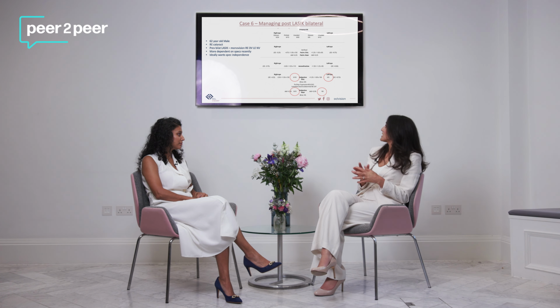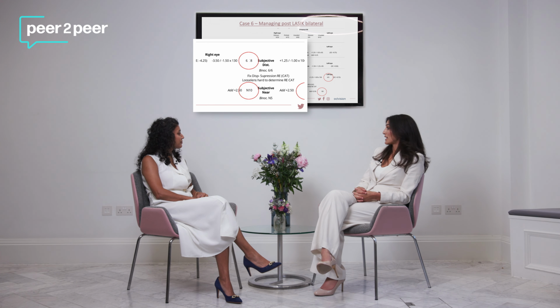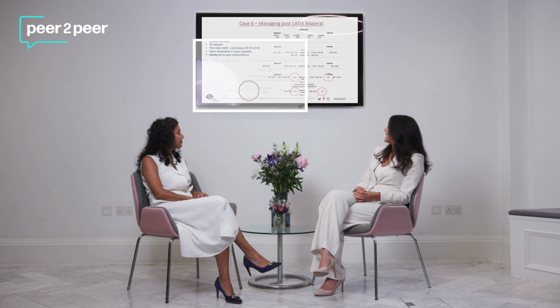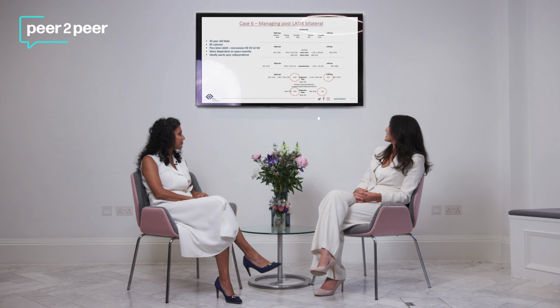So when we're looking at his vision, you can see that it is reduced. He's myopic in that eye, so he's had some degree of regression over the years, or he's developed myopia due to the cataract, as it's probably a combination of the two. His best corrected vision in the right eye is 6/18, and with a 2.5 add, he's N10. In his left eye, he's seeing 6/5 with best corrected vision, so he doesn't want that eye touching just yet because his vision in that eye is pretty good.